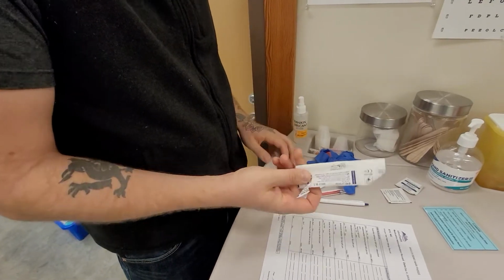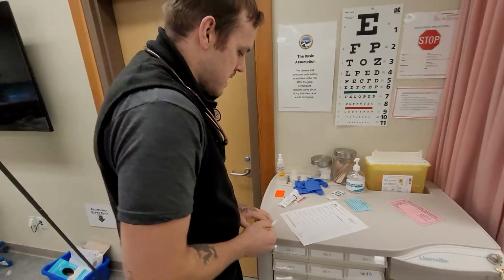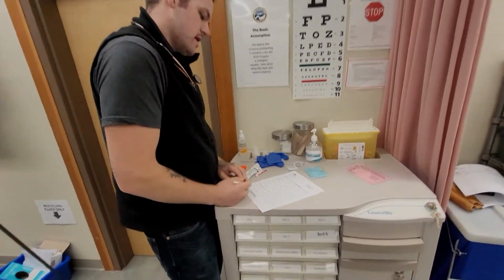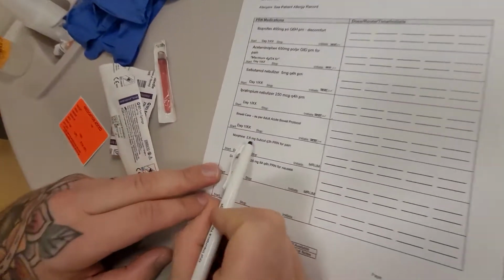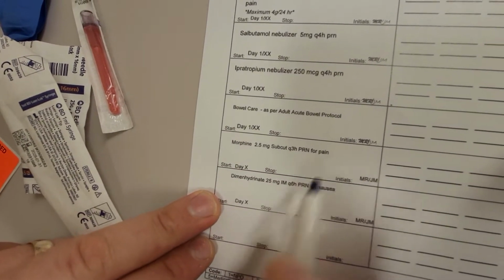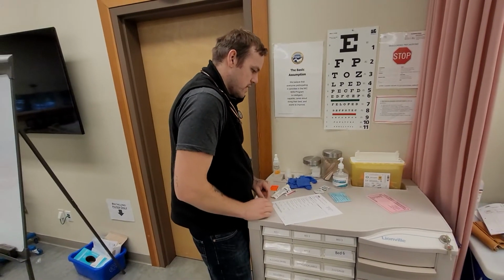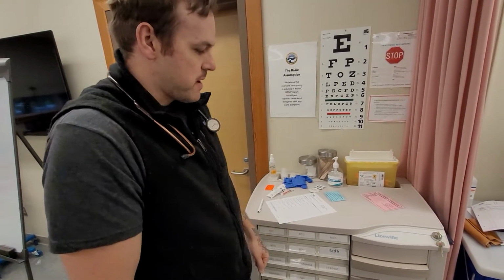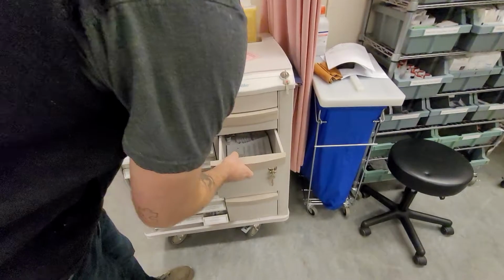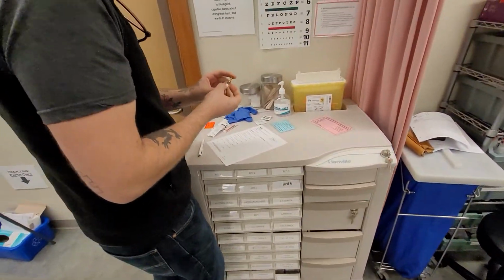I checked the expiry and none of that stuff's expired. So we're going to check the MAR and see what we need. We can see here that morphine, 2.5 milligrams, sub-Q, Q3 hours, PRN for pain. So what we're going to do is take the medication out of the drawer. Go to our narcotics container, and we're going to complete our first check.